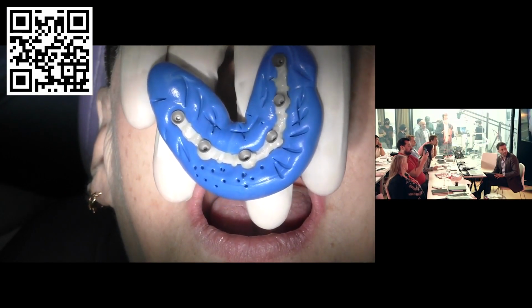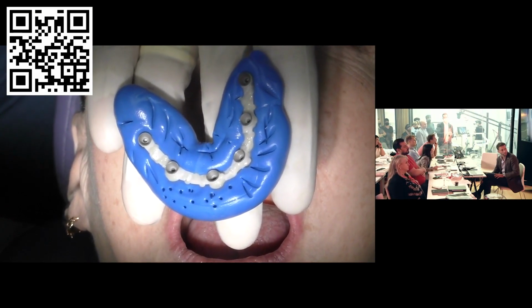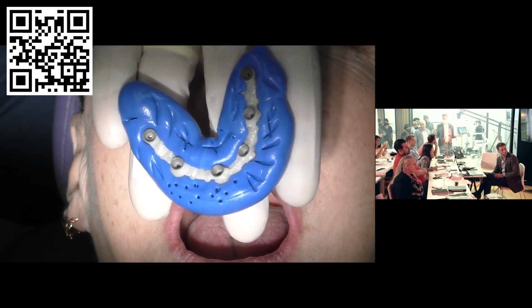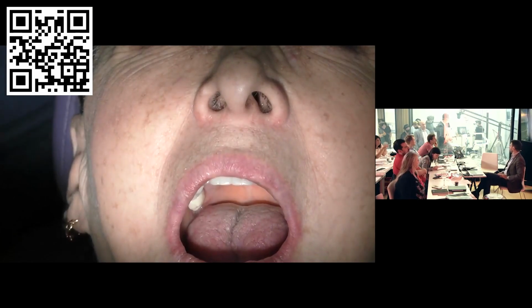So we place this silicone there, we place the bar, because the only thing that we really need is the T-base, that connection, the circle, is the area that the lab needs to make the correction in the scanning. So that is exactly what we are going to do.